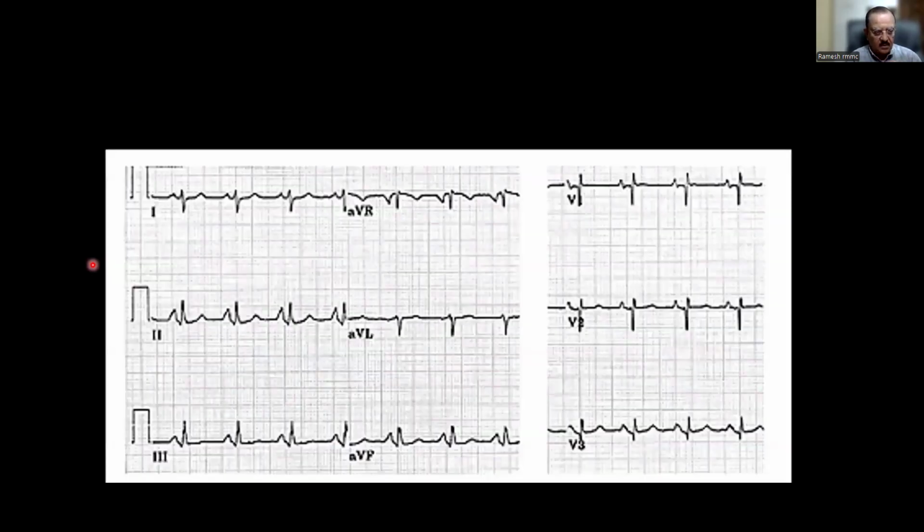See here. What do you think? Concentrate on lead 2. I told you for the P wave, look at lead 2. What do you think this P wave is? Right atrial enlargement. Excellent. So it is an abnormal P wave. Where is the abnormality? The abnormality is in the height. Amplitude. Very good. Technically correct. Any problem in the duration?